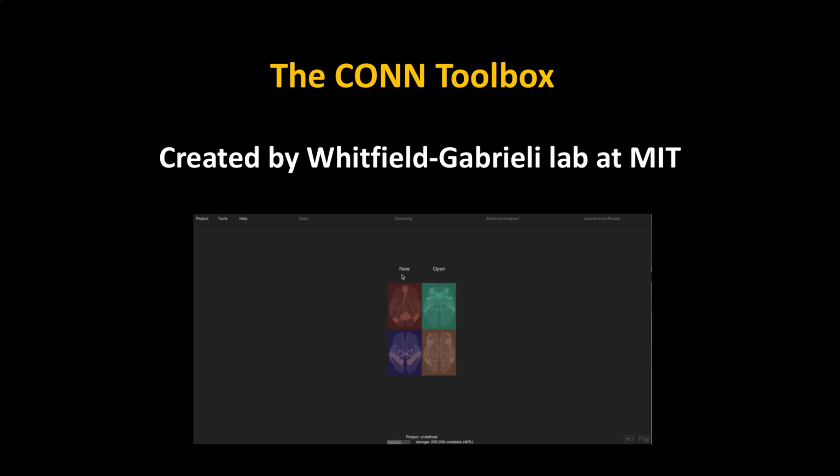And what I like about it, besides the fact that it's been supported, it's been developed over the years, the interface is very clean. It's one of the cleanest toolbox interfaces that I've seen. It's not too flashy, but it does give you everything you need. It works through everything in a very logical, consecutive sequence. And I hope you'll see how once you get a grasp on how to analyze a single subject and also a group, how easily you can apply it to any data set. Maybe. But I hope that is how it's going to work out.